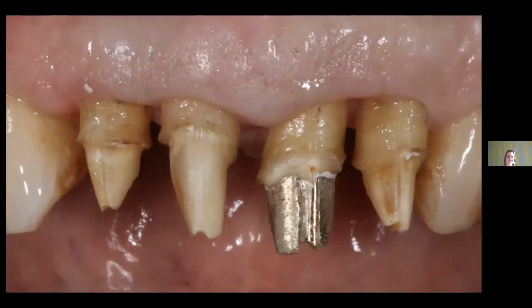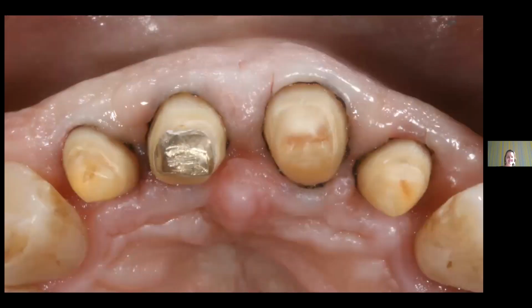What I'm saying is that once you create a horizontal margin in a tooth, it's there for life. And now you can see that the tissue has moved, so we have to either reprep that horizontal margin or get rid of it. If we reprep a horizontal margin more apically, we're going to lose just about all the tooth structure, certainly when you see the extent of the apical migration of the soft tissue. This is where a vertical preparation becomes the ideal treatment. If you can imagine cutting a millimeter shoulder or deep chamfer on those teeth, there would be nothing left of them.